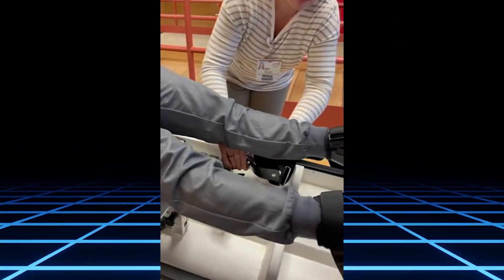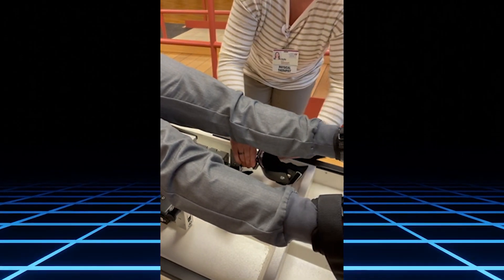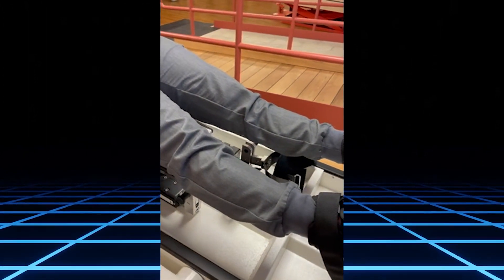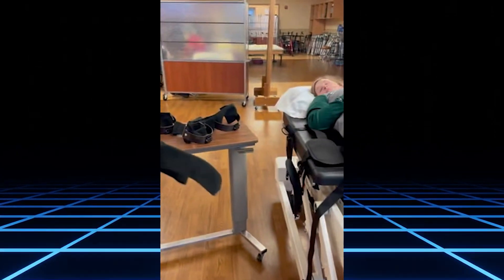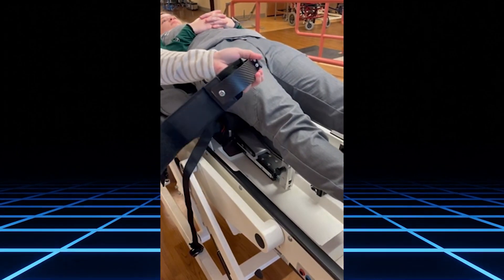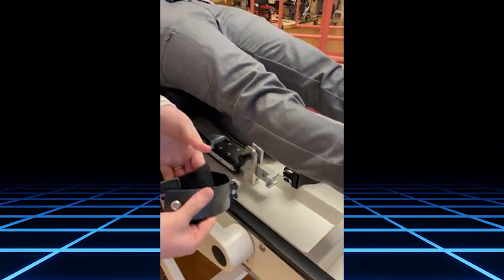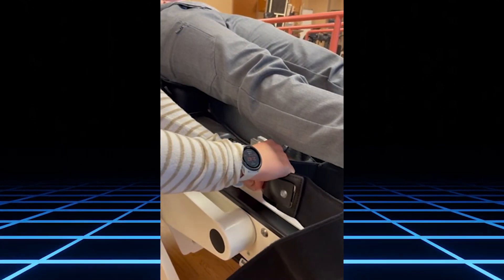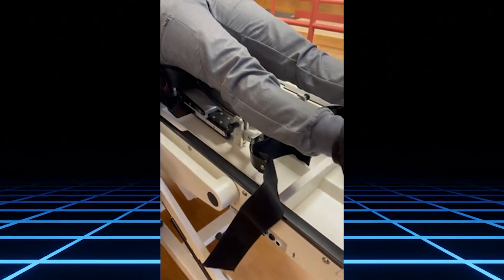Put this in here and then I will walk around to the other side to show you how to slide these cuffs in. I have this size seven cuff — you always want the tail to be out. It slides into here; there is no locking mechanism, you just have to make sure it is fully in.